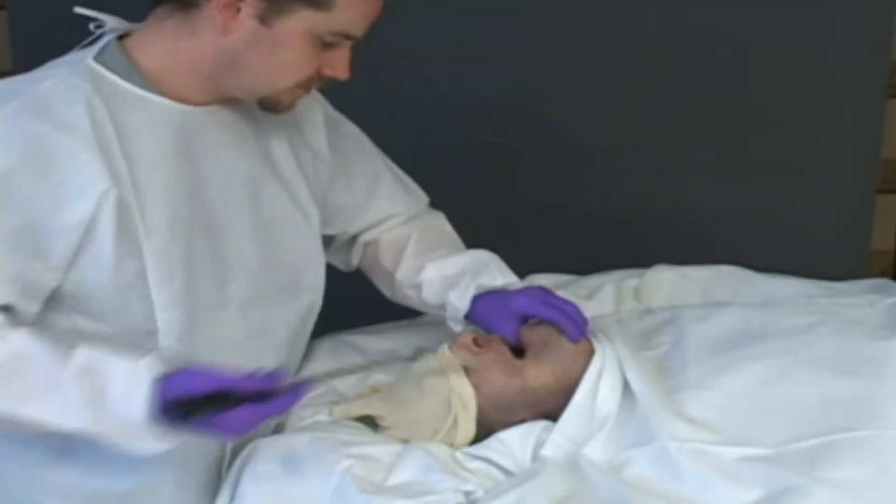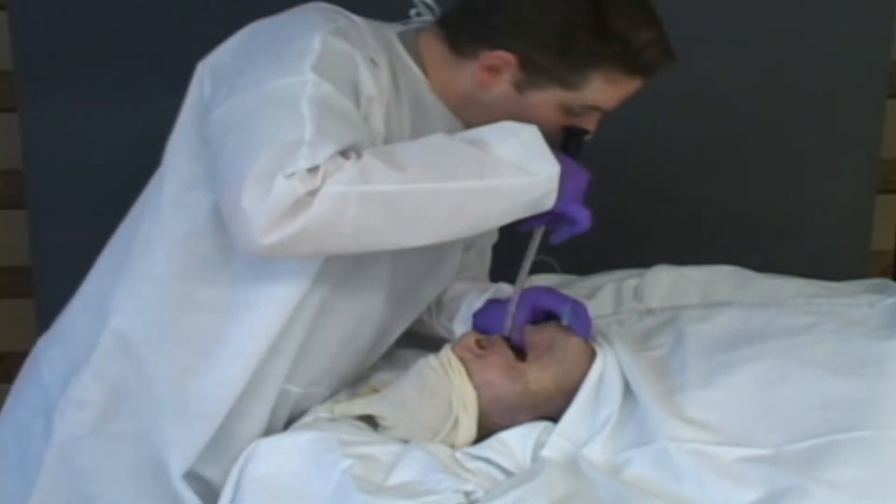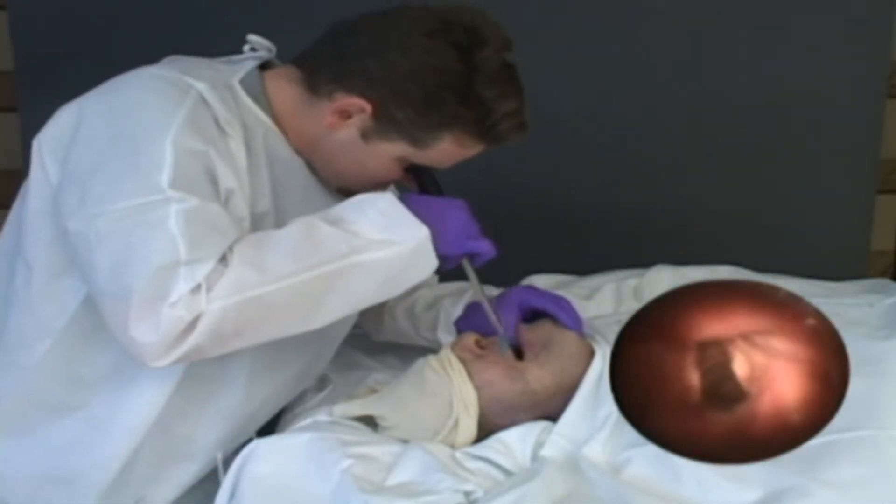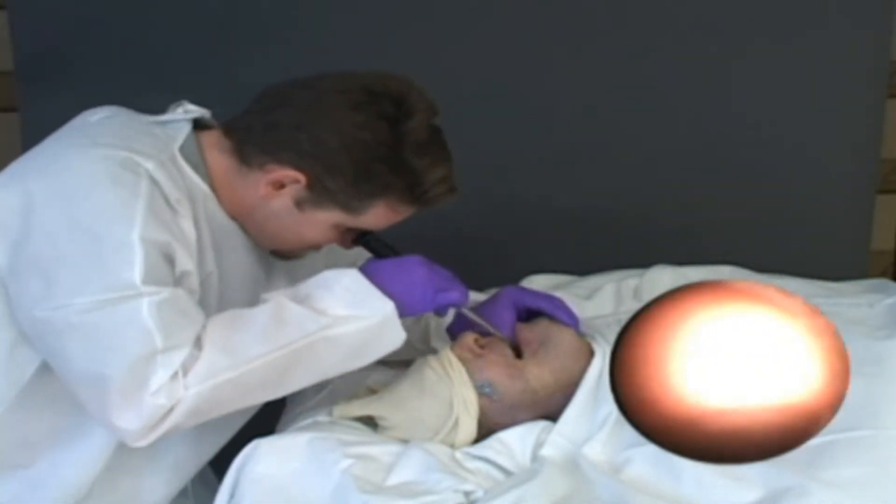Procedure for using the device without a laryngoscope. For operators comfortable with fiber optic anatomy and the subtleties of handling a fiber optic instrument, it is very easy to use the FPS as an independent device for intubation.